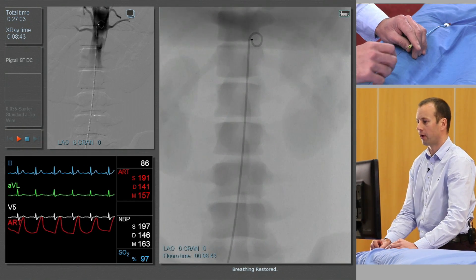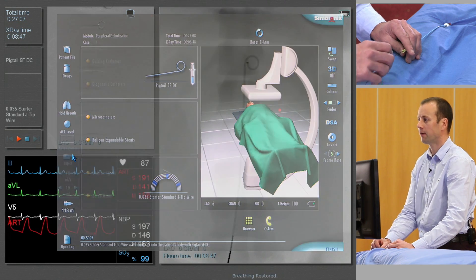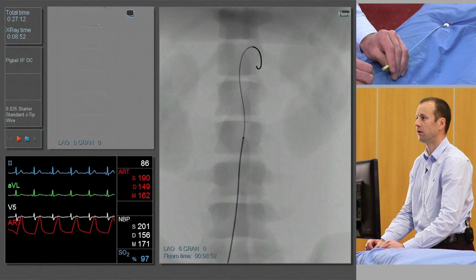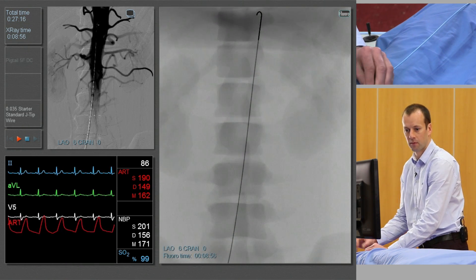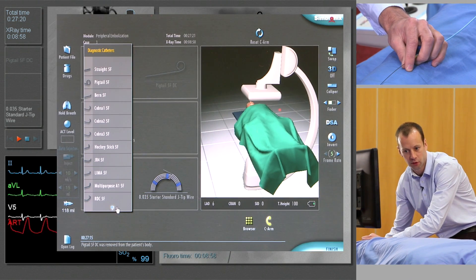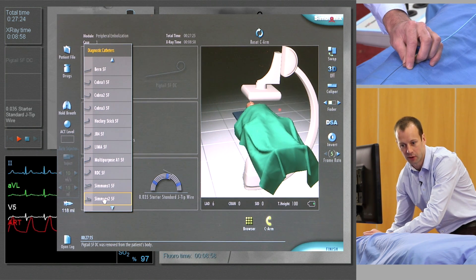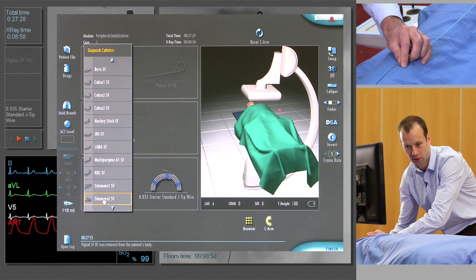So we'll remove the diagnostic catheter — the pigtail catheter — and reinsert the guide wire. We're going to replace it with a catheter that will let us engage the superior mesenteric artery. For this, we need a reverse-curve catheter, typically a sidewinder, otherwise known as a Simmons II catheter.